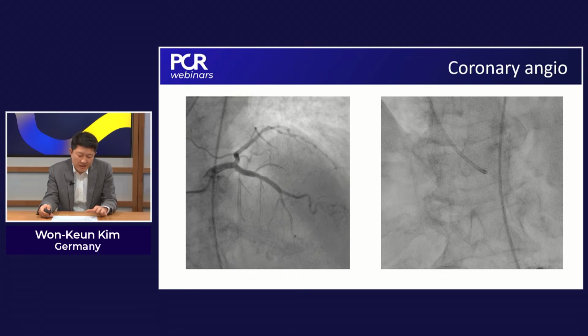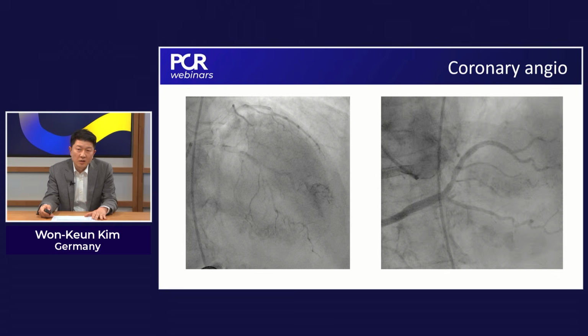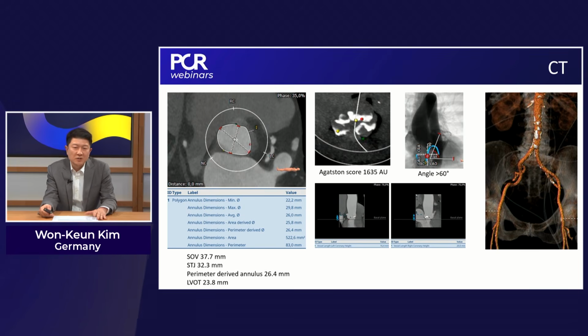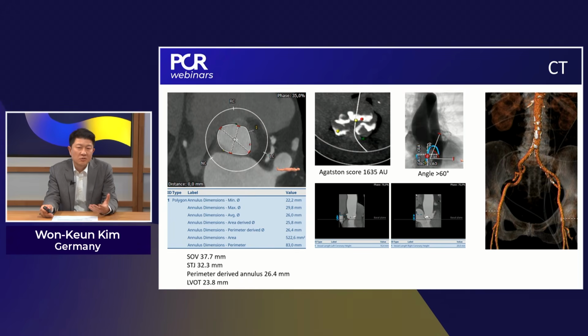We had this discussion, and in this case, coronary angio was performed. It's open to discussion. The new guidelines say it depends on the pretest probability, but this is a little bit older case, and you can see no remarkable target lesion in the coronary angio. But I think for TAVI workup, CT stays the key modality to assess feasibility, risk stratification, and to employ a good strategy.